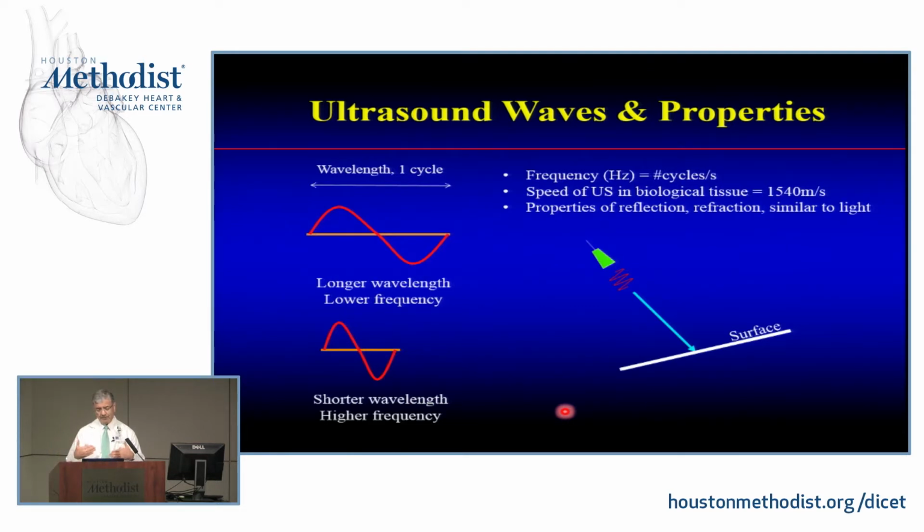But just imagine if the surface is very reflectant, like calcium or metallic things, it's going to bounce back quite a bit from it. Besides bouncing back, most of the time it can travel through, just like if you shine a little wave on a surface of water, it's going to be deflected. So this is refraction. And then reflection is almost symmetrical to the perpendicular on this. So you see this being reflected up.